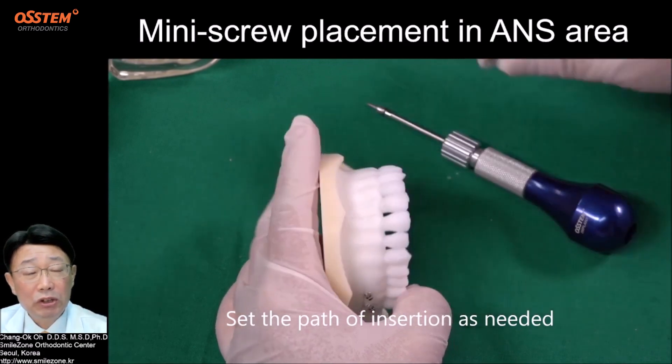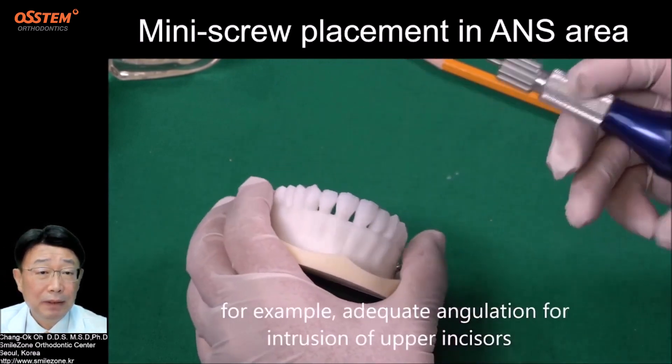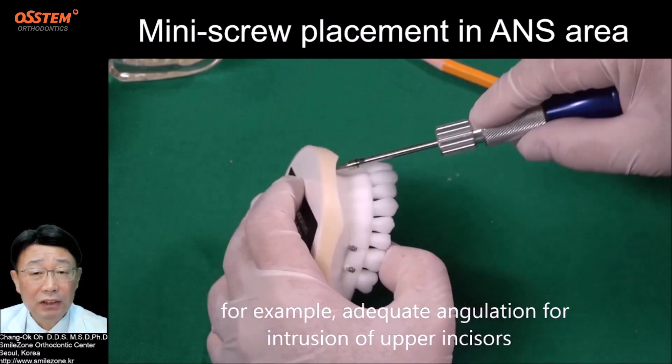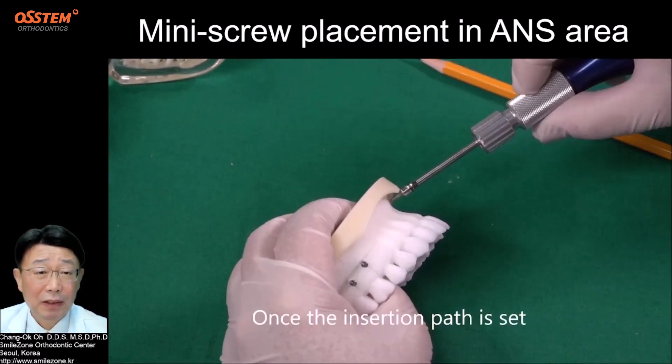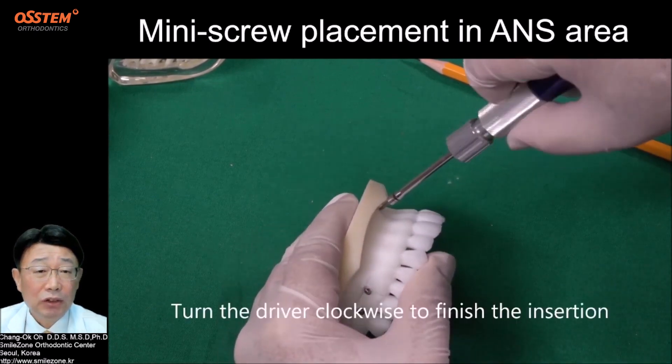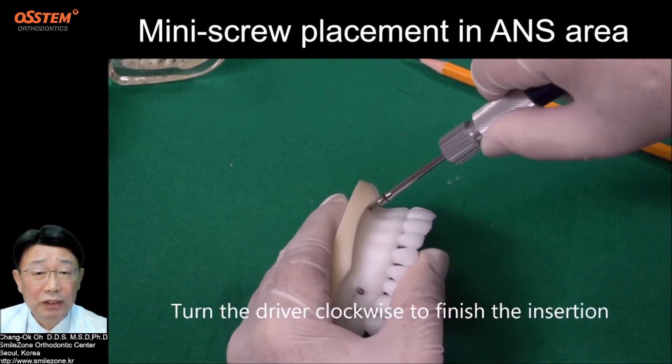Set the path of insertion as needed — for example, adequate angulation for intrusion of upper incisors. Once the insertion path is set, turn the drive clockwise to finish the insertion.